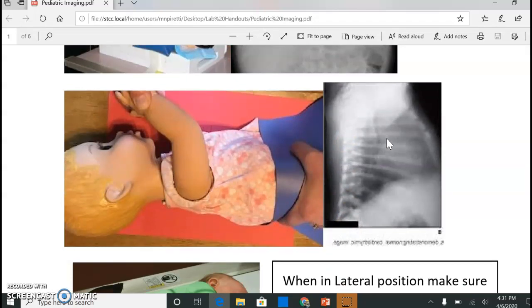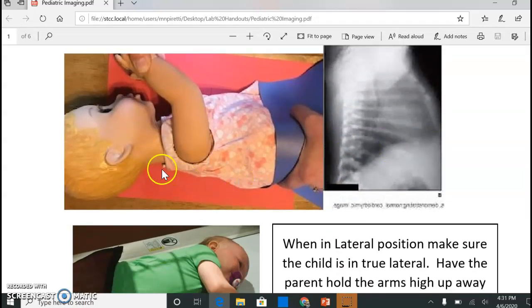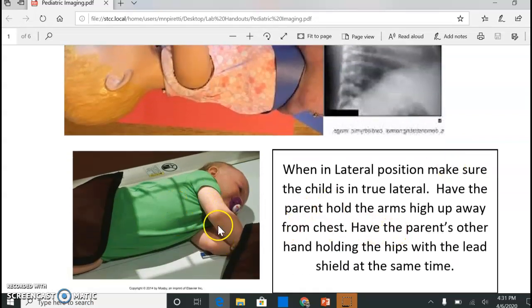For lateral positioning for infants, make sure you're doing a true left lateral. The arms need to be up and out of the way. Have the parent in the front of the child so the child will look straighter if they're looking at their parent. Hold both arms in the front. I use a lead shield underneath my hand and hold the hips at the same time, so you're controlling both arms and hips. This little guy seems quite content, but I'd say that's rare in this situation.